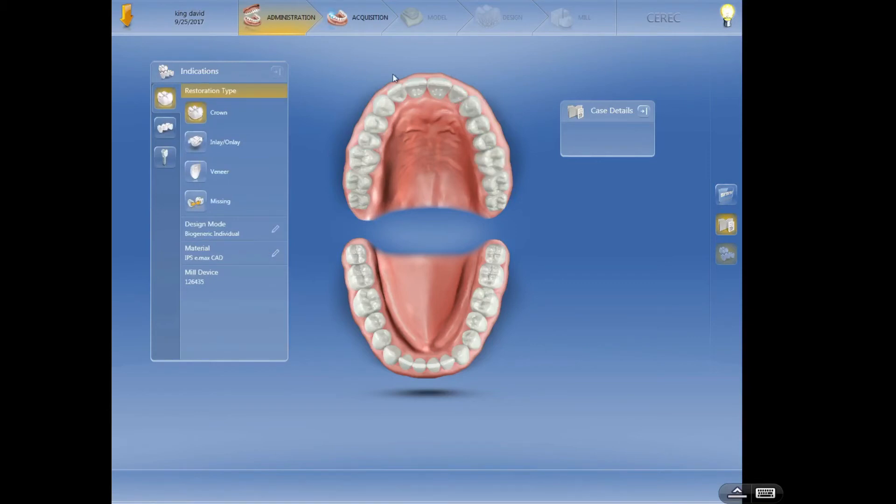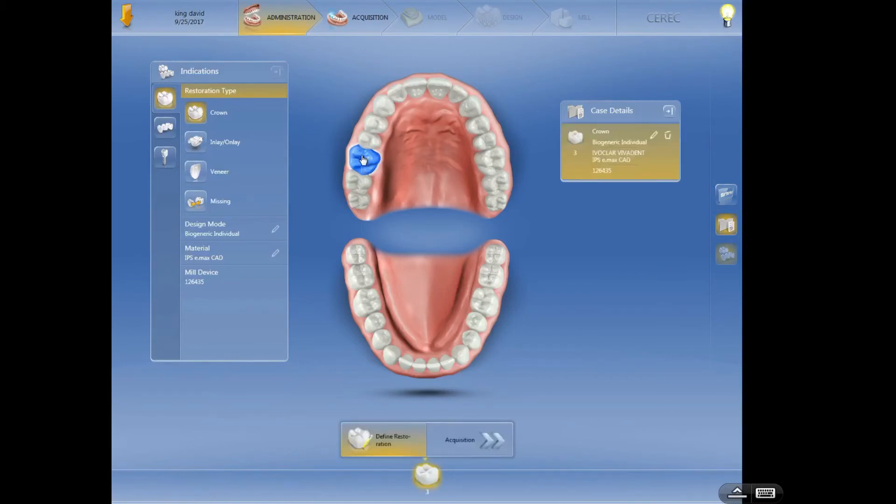And then we select the teeth. So let's just say we're doing a crown on tooth number three. I'm going to select three. I just clicked on it once. Now look over here, we've now got this individual little file for this case, tooth number three.